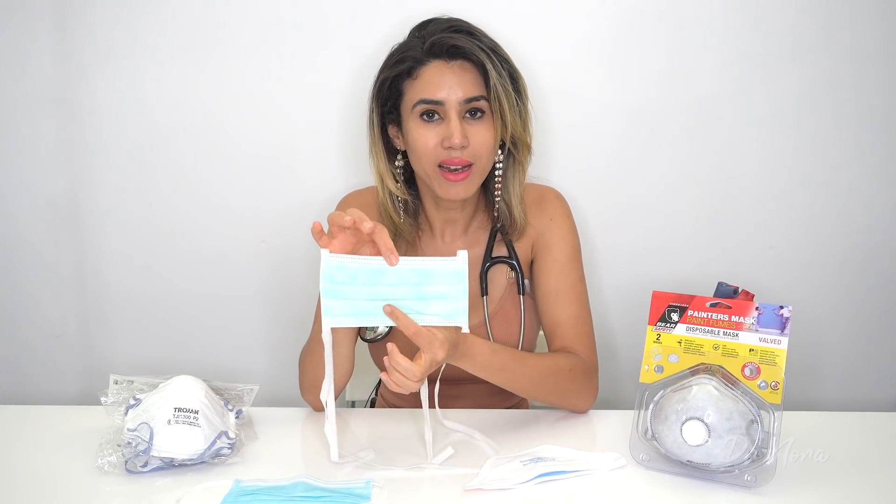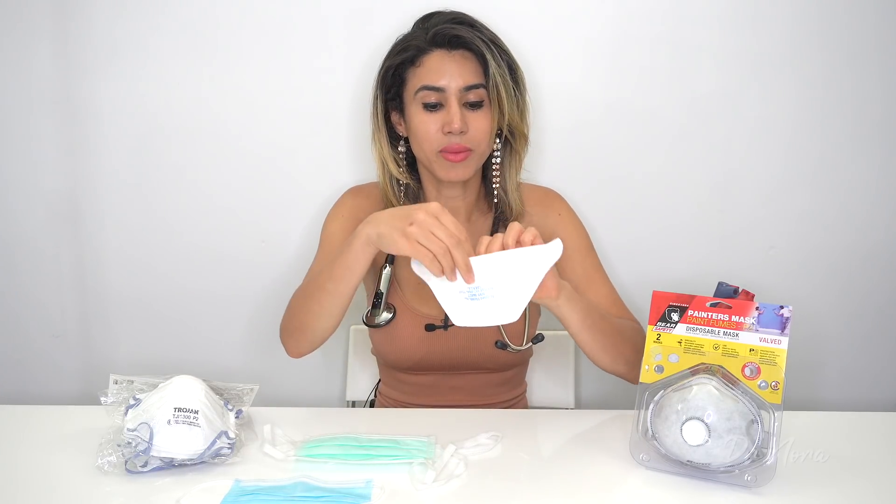What's also important to note is that the N95 masks and the P2 masks come in different sizes. For example, this N95 respirator is a standard size, and this N95 respirator is a small size, so this should only be used on children whereas this one should be used on adults. Obviously, getting your size right is important because if you haven't got the correct size, you're not well protected.